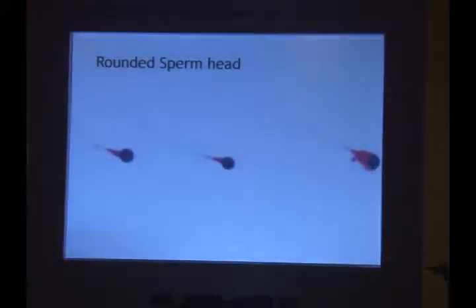These are the round-headed sperm, what we call cases of globosospermia. I used to feel the answer is simple. These sperm don't have an acrosome, so they cannot fertilize on their own. So you can't succeed with IUI or even IVF, but you will definitely succeed with ICSI.